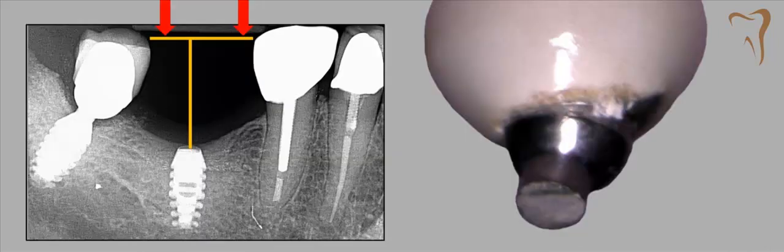And this is an interesting case that hasn't come in yet, but it's just referred in, and I put it in last week because look at the torsional loading that occurred on this and the abutment breakage. The problem is that you think, well, how long did it take to break? These two implants were in the mouth for about 13 years. But the really interesting fact about this is there was no posterior occlusion in her mouth when she was examined by the prosthodontist that sent her in. So all she does is function on her anterior teeth. Now, it may not have been that way for the last 12 years, but it was certainly that way now, and she broke it. Maybe that's why it lasted as long as it did.